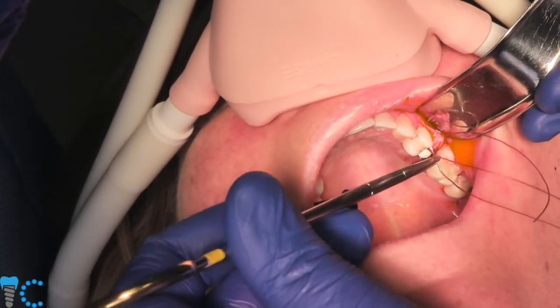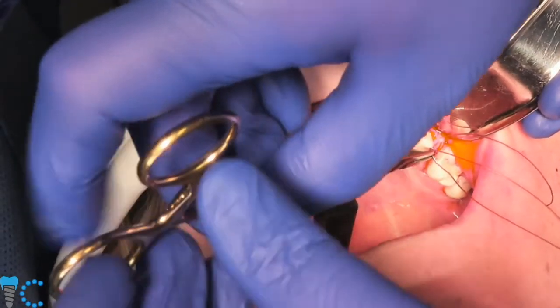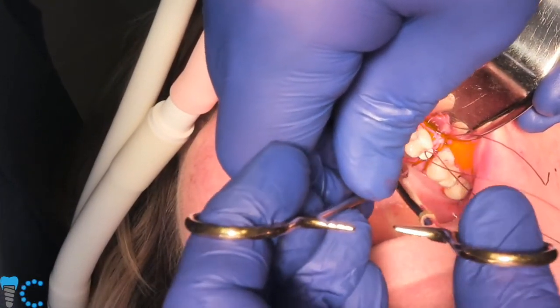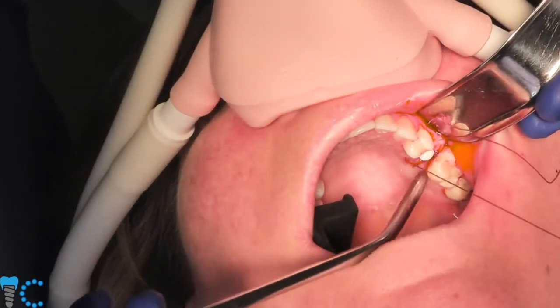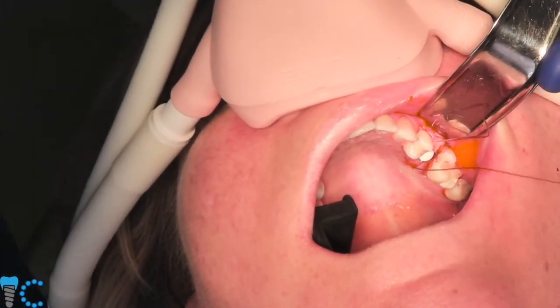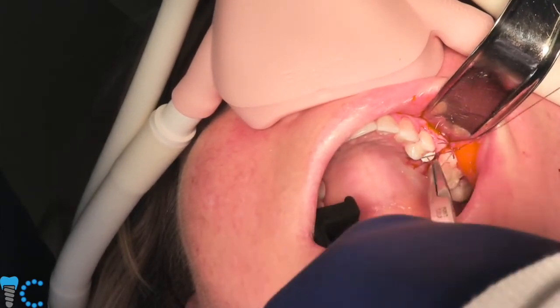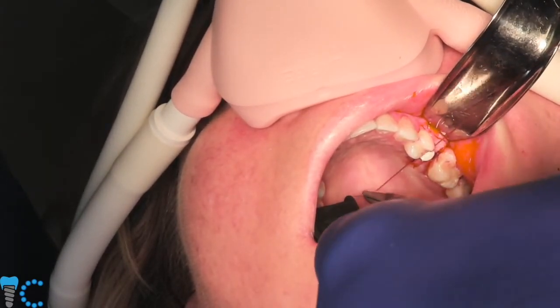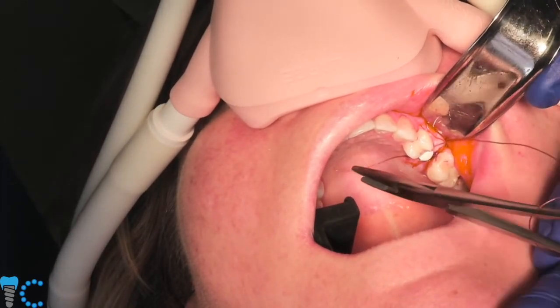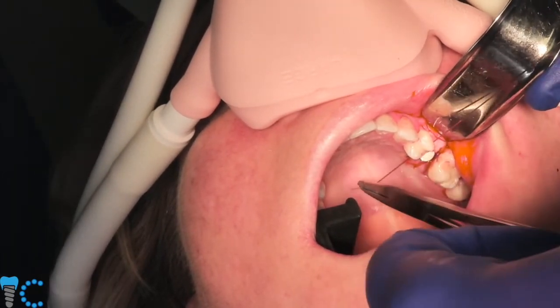And again, I think the problem often is patient function. For example, if you design a flipper, patient wants to wear an interim prosthesis, and that flipper bangs on your implant, well, even though you did this great implant surgery, the reason your implant's going to fail is because you were a little sloppy on the adjustment of the flipper. The devil is in the details. So the occlusion of your crown, the quality of the implant placement, the quality of adjusting your flipper. These little details are the things that are going to make you have failure.